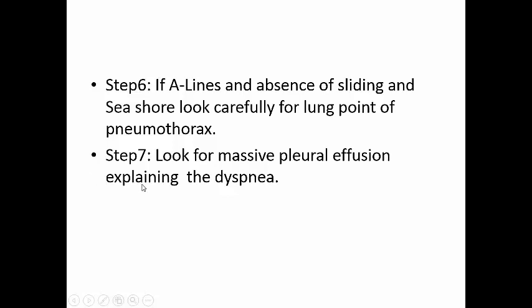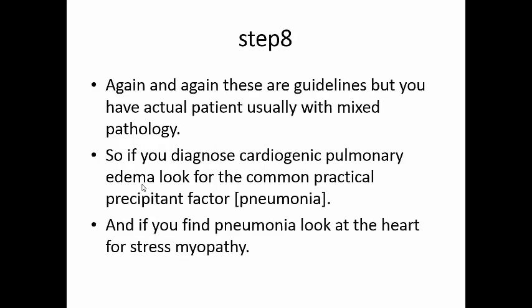The next is the most important step in our protocol. Step 8, again and again. These are guidelines, but you have actual patients usually with mixed pathology. So, if you diagnose cardiogenic pulmonary edema, please look for the common practical precipitating factor, which is pneumonia. And if you find the pneumonia, look at the heart for stress myopathy and the other lesions.